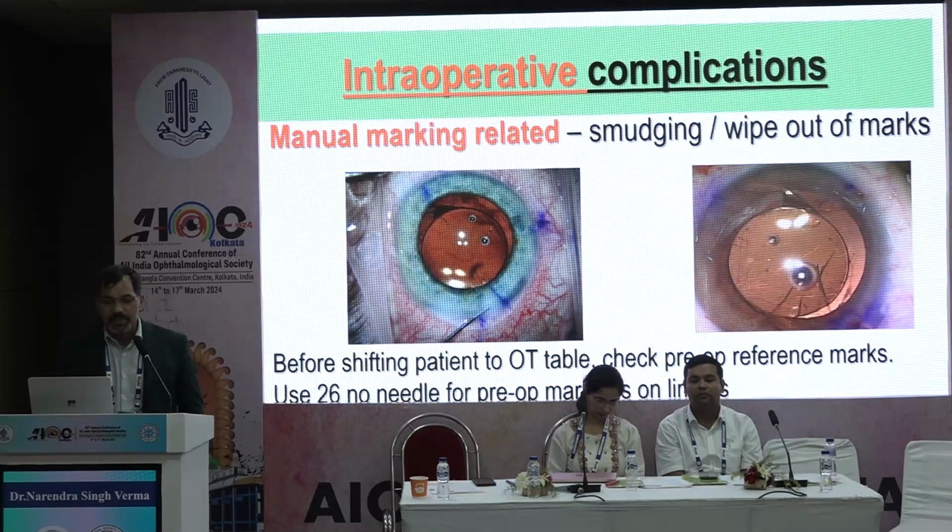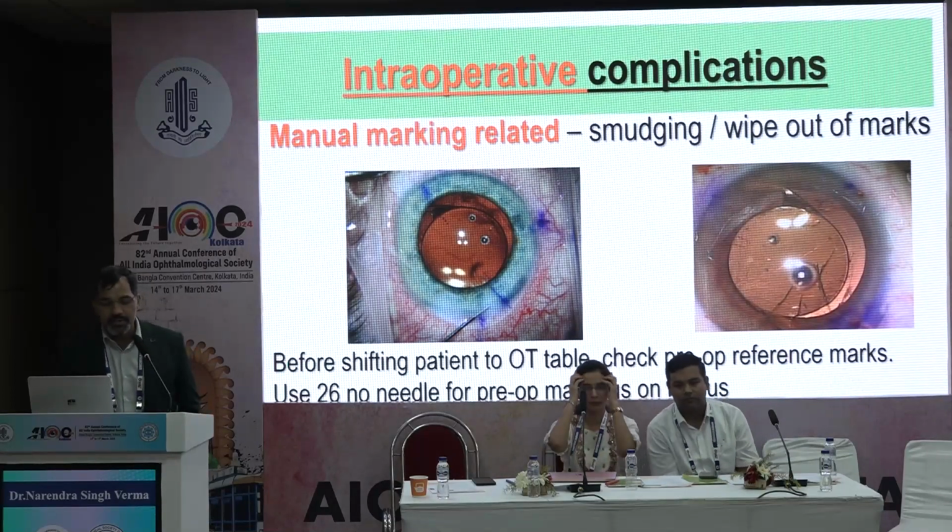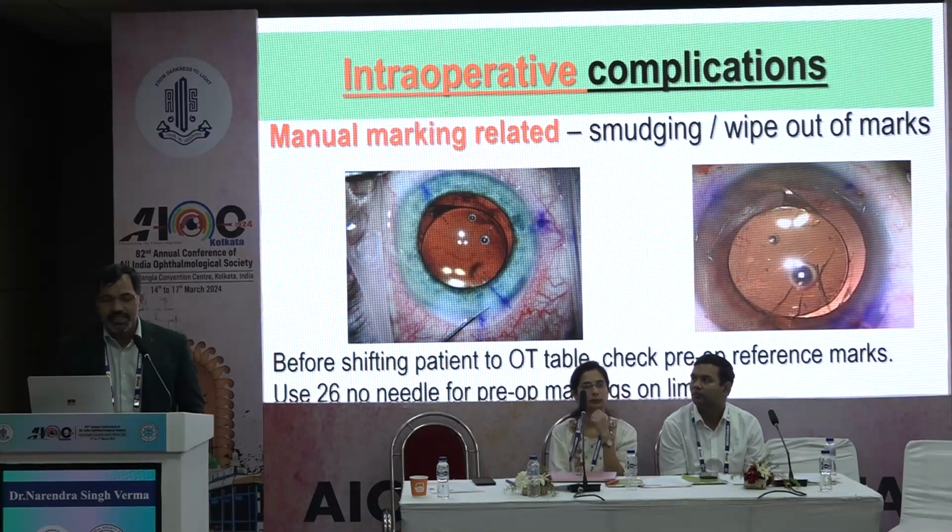So when we shift the patient to the OT, before shifting the patient to the OT table, you check the operative reference marks. So if reference marks are not there, even in the OT, let the patient sit, you can do 180-degree marking, freehand marking is possible.